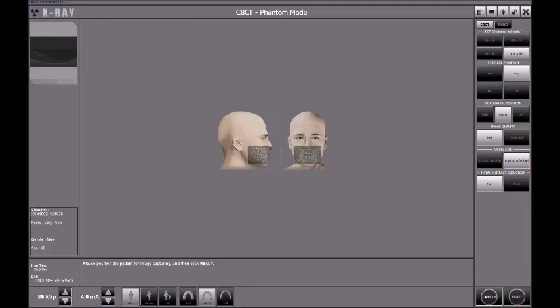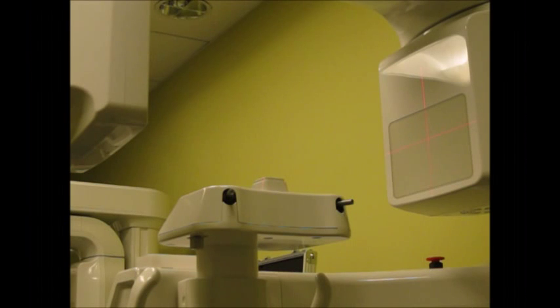Once you see that the ready button starts to blink, then you will know that that is when you have to position the phantom kit on top of the chin rest. I will now explain how to place those phantoms on top of the chin rest so that you can perform your inspections for both CT number and uniformity tests. Let's start with CT number.